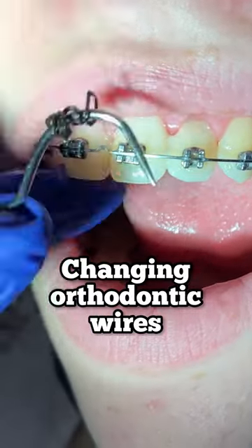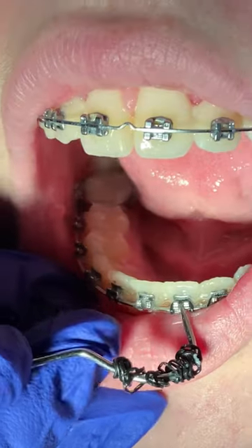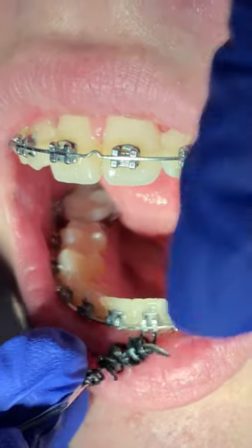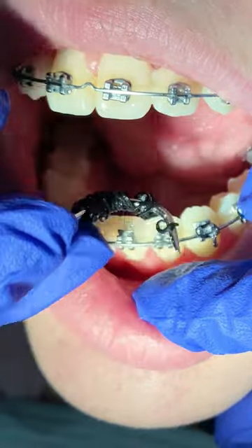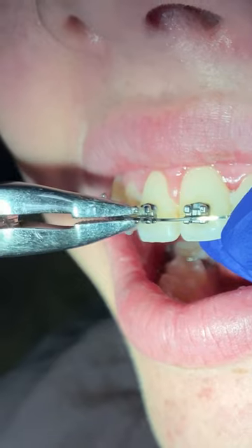Hey everyone, this is Abby, your hygienist here at Tooth Time. Today's video we're going to show you how we're going to transition to a new wire. This wire is what we call an 18 by 25 NiTi — it's a heat-activated wire, which means it can activate with the warmth of your mouth.